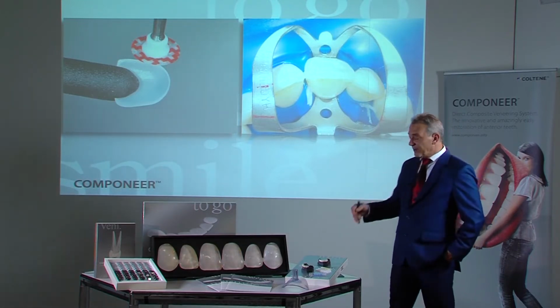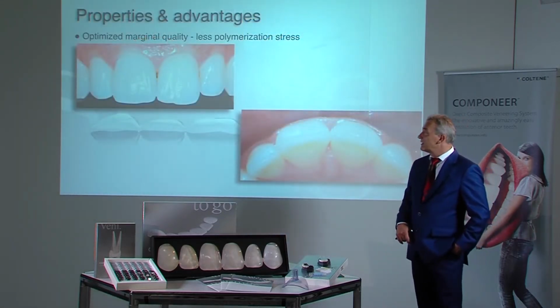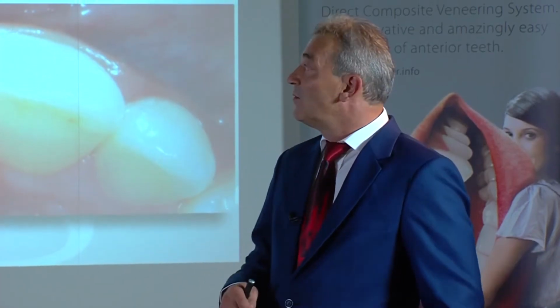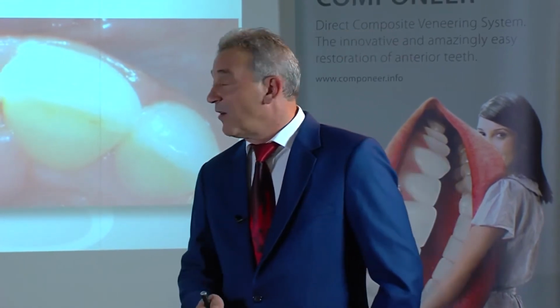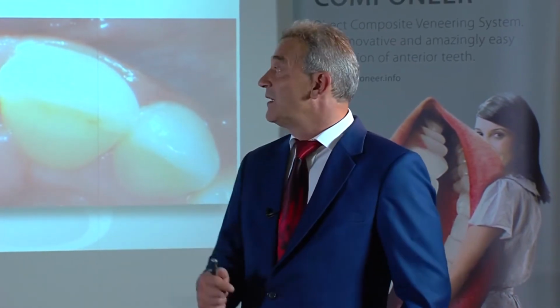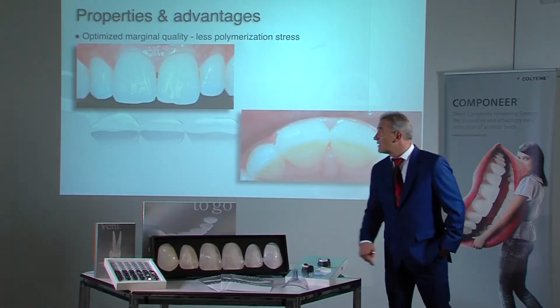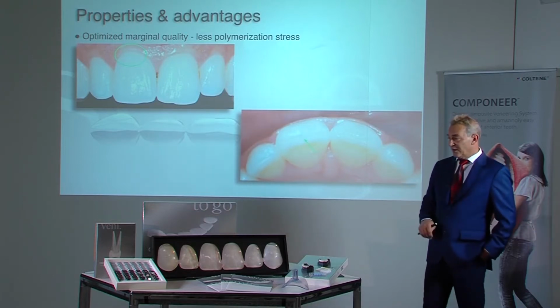The objective and purpose of an individual restoration is to restore surfaces as atraumatically as possible, or with little trauma. This is consistent with the Componeer in obtaining a higher quality restoration than compared with the direct technique. This also applies to the quality of the margin in the cervical and incisal region.